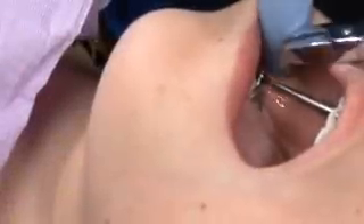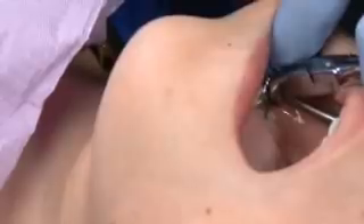The telescoping rods do not need to be disengaged in order to place the C-spacers. Simply have the patient open his or her mouth, place C-spacers over the rod, then crimp with the ORMCO C-spacer crimping plier. The C-spacers will slide up and down the rod.